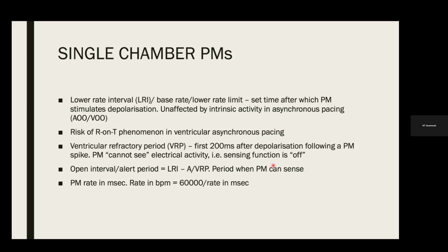So first, others will call it the lower rate limit. And this is the set time at which the pacemaker spikes will be fired. If you're doing single chamber pacing, once that rate interval has elapsed, it will fire a pacemaker spike.